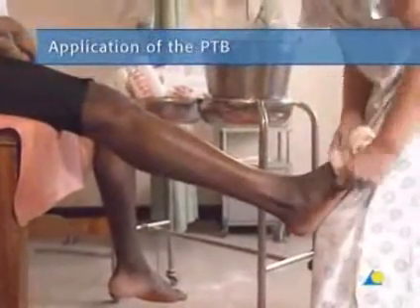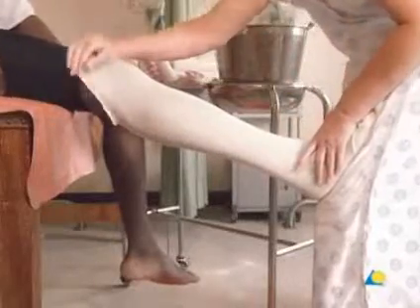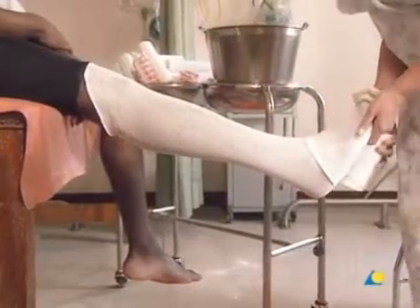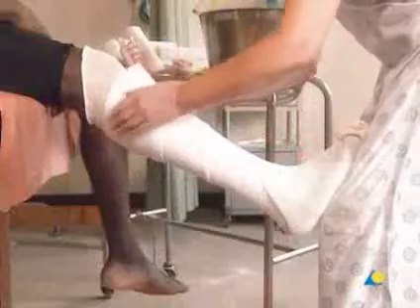To begin, a stockinette is applied and cut slightly longer than the final cast will be. Starting at the distal border, the cotton wool is gently wound on, once around the foot and then around the ankle in a figure of eight, making sure that the edge does not cut into the 90-degree bend of the ankle. The cotton wool is wound towards the knee, giving an overlap of one centimeter, which provides a single layer of padding and ensures a secure fitting cast.